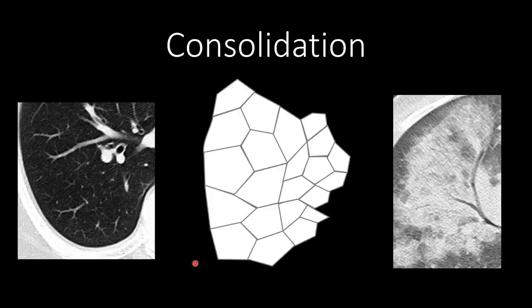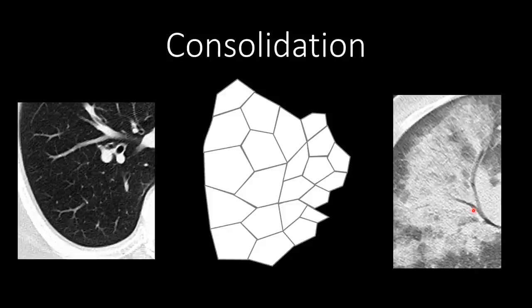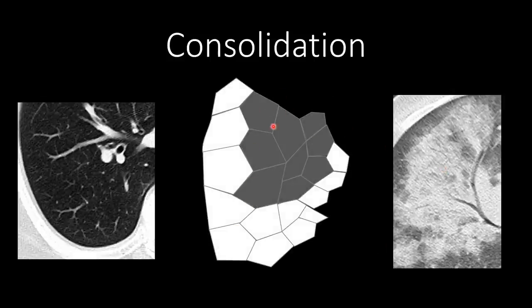Consolidation is complete alveolar filling, making it more dense than ground glass opacities. Here we have a normal lung, nice and black with vessels and airways easily seen, compared to a lung with diffuse consolidation in a patient with ARDS or acute respiratory distress syndrome. Within consolidation you start to see airways as air bronchograms, and you no longer see distinct vessels within the area of consolidation.